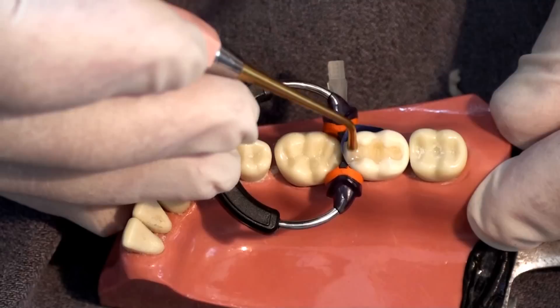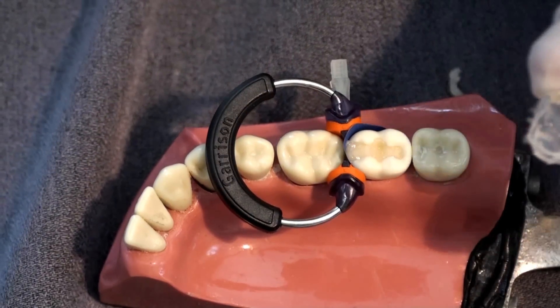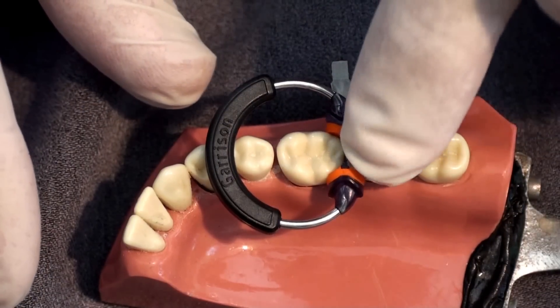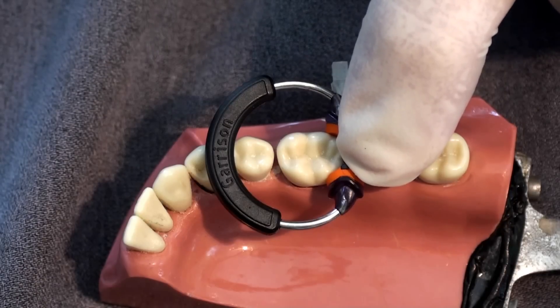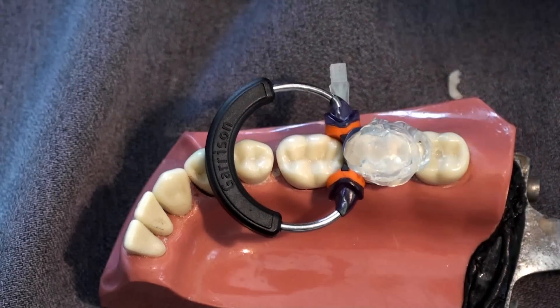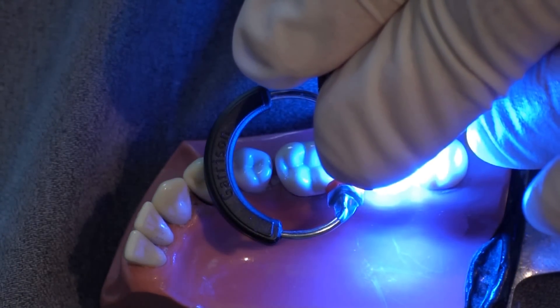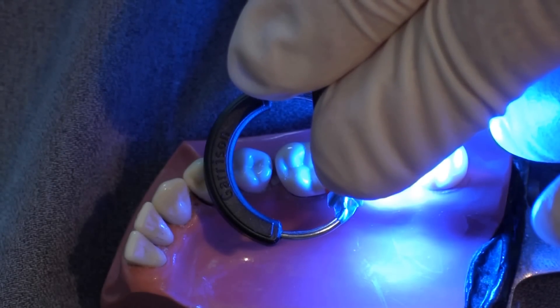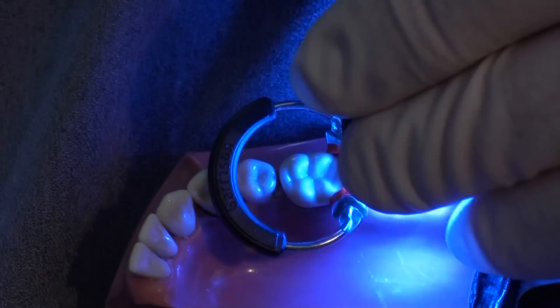We think we're pretty close to where we need to be. Now we're going to take the clear custom matrix and reseat it back on the tooth — it should fit like a glove. I put about five pounds of pressure on this while it forces the composite into the original shape of the tooth. I do this for five to ten seconds with my finger, then take the light curing bundle, match it up with the flat surface created by the mylar strip, and apply pressure as I cure through it — curing in the original anatomy, surface texture, and occlusion, and creating a surface that is not air-inhibited, needs no polishing, and is hard and smooth. We cure this for 20 seconds.